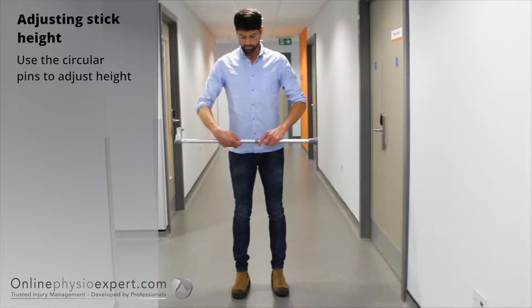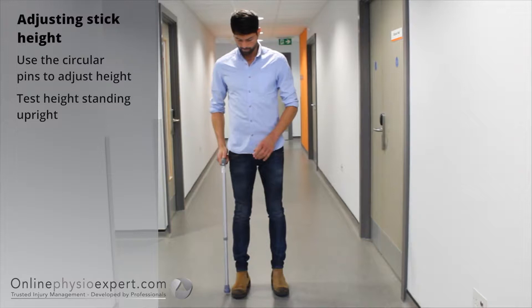Before using a stick you may need to adjust it to the correct height. The top of the stick handle should lie just below your wrist crease line.